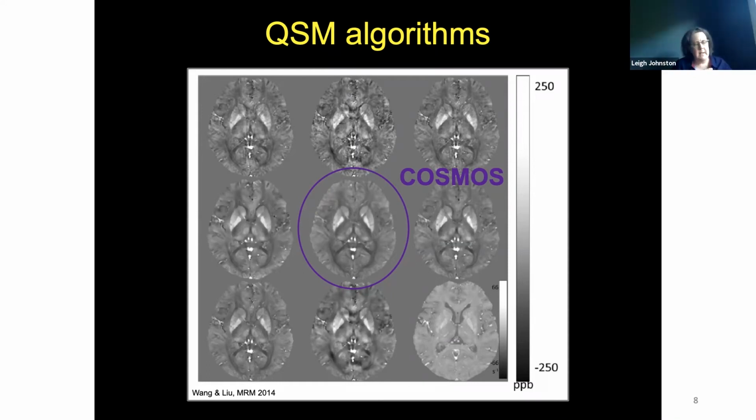And in a clinical setting, certainly nobody has that kind of time to waste, particularly when you're up against a CT machine, right? And the CT does things like this, and the criticism of MRI is always it takes so long, all right? So you're not going to get anywhere with clinicians if you tell them that they have to take 5 times as much data to get there.